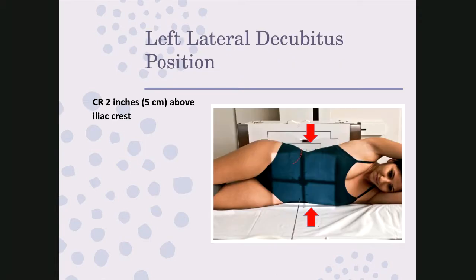And notice at the top it says a lateral decubitus position, and it calls it an AP projection because in this particular picture, the woman is in an AP projection. And remember, projection is the path of the central ray, meaning if you were the central ray, how is it passing through the patient? And in this particular picture, it is passing AP through the anterior aspect first, and then the posterior aspect.